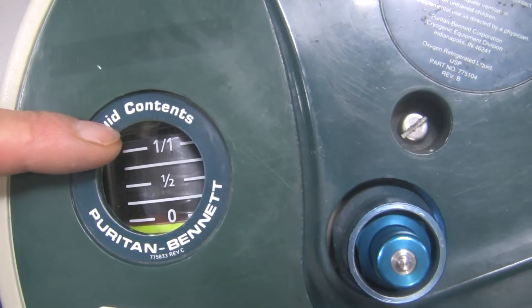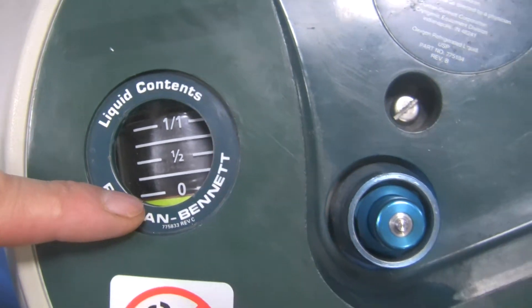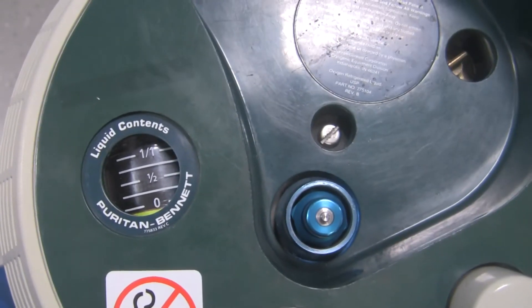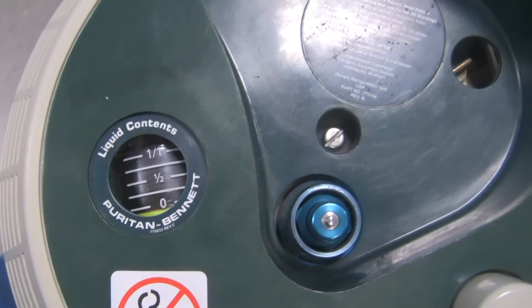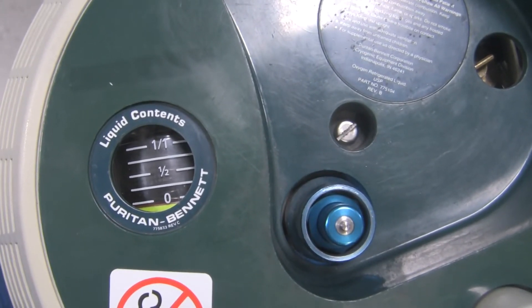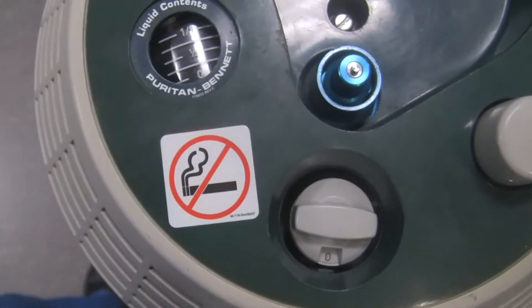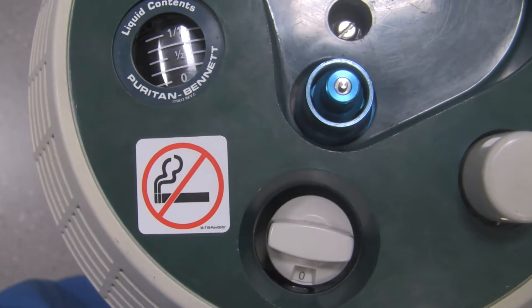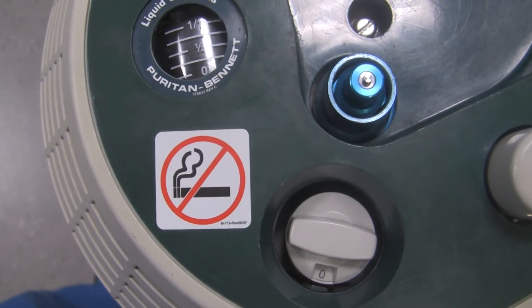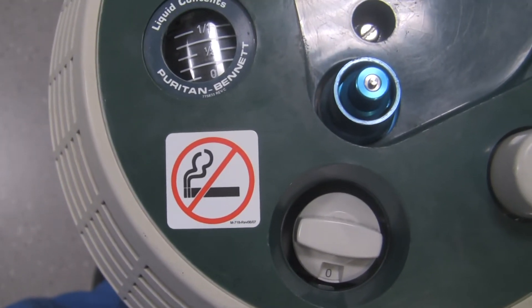The gauge shows three quarters, half, quarter, and empty. Whether you use the liquid oxygen inside or not, it will eventually leak out because the thermos bottle, as efficient as it is, will still allow some liquid oxygen to convert to gas and eventually escape. There's also a non-smoking sign as a reminder that nobody should be smoking near this equipment or lighting a match — keep it at least three to five meters away from any ignition source.